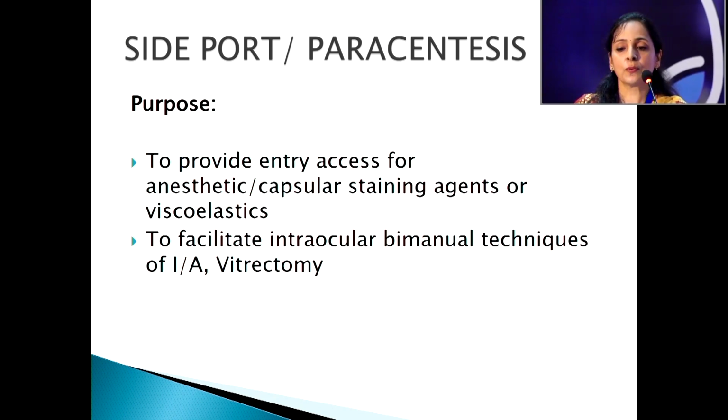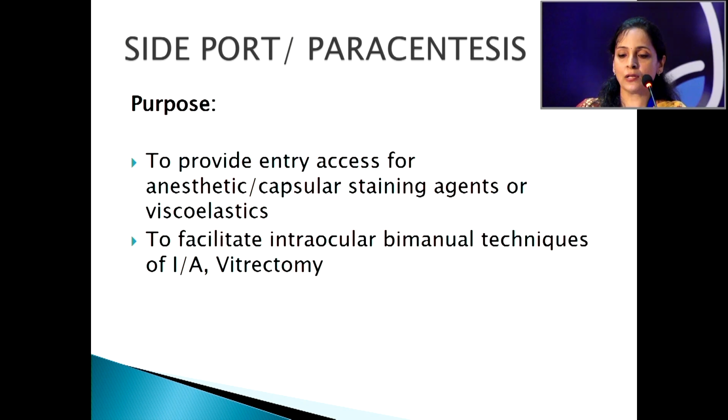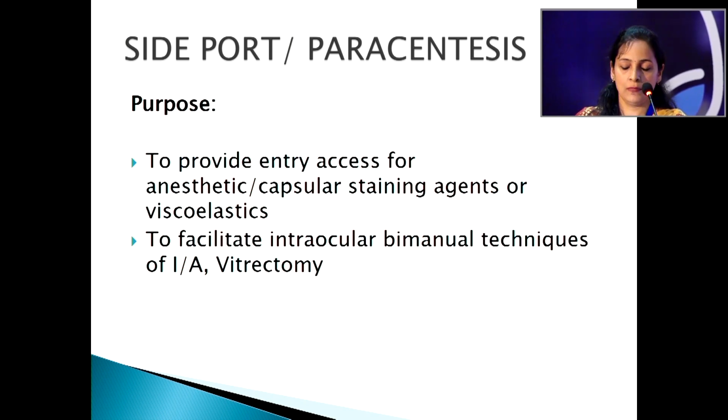So the purpose is to provide entry access for anesthetic or capsular staining agents or viscoelastics, and also to facilitate the bimanual techniques of irrigation and aspiration, or in complicated cases, vitrectomy.